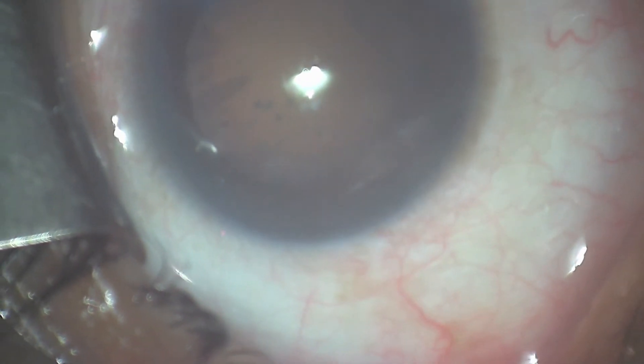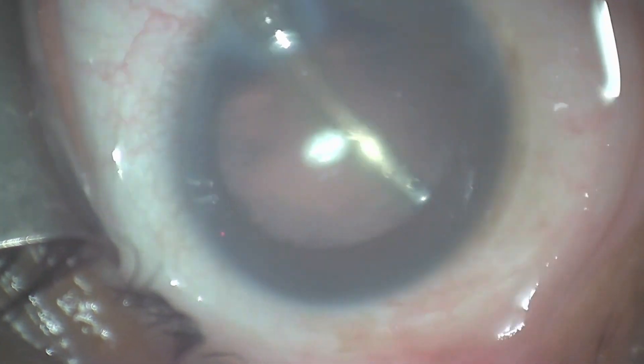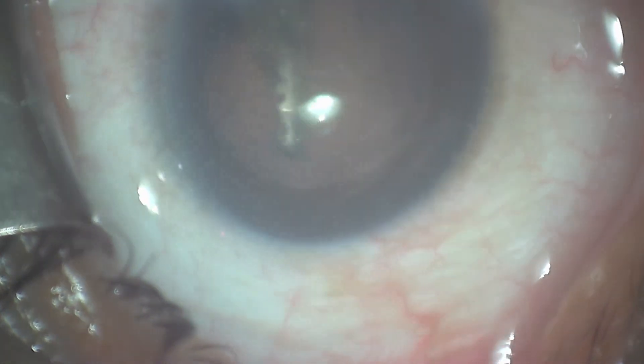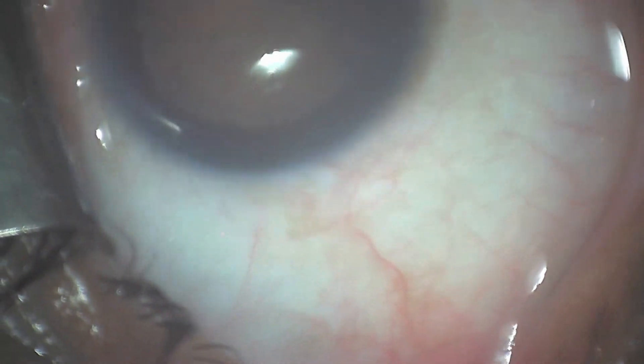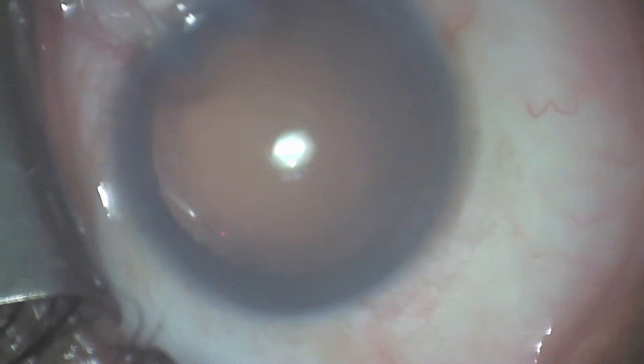Once the lens has been emulsified, there is usually a minimal amount of cortical material left inside the capsular bag. That's usually relatively easy to remove — the small amounts of cortex — since the majority of this was lens nucleus, which has been previously emulsified.